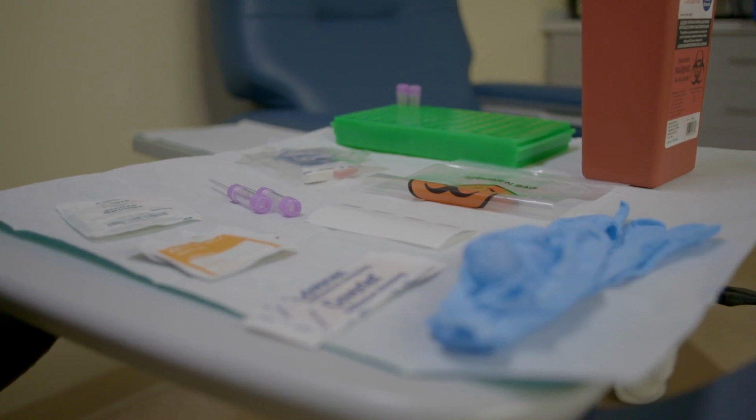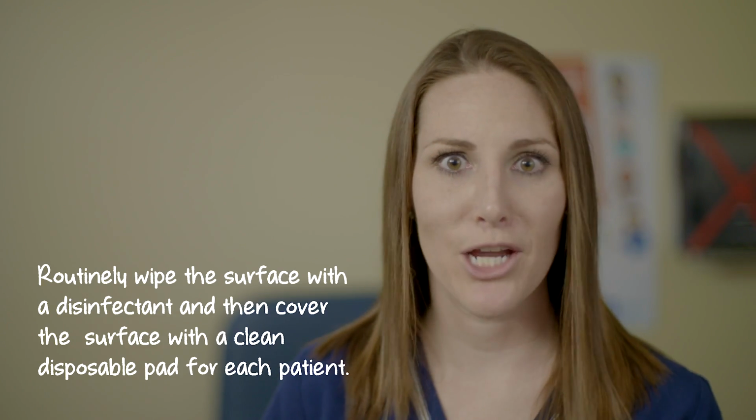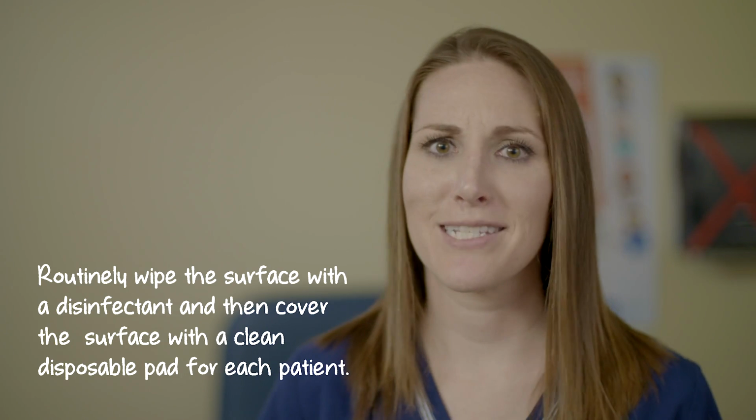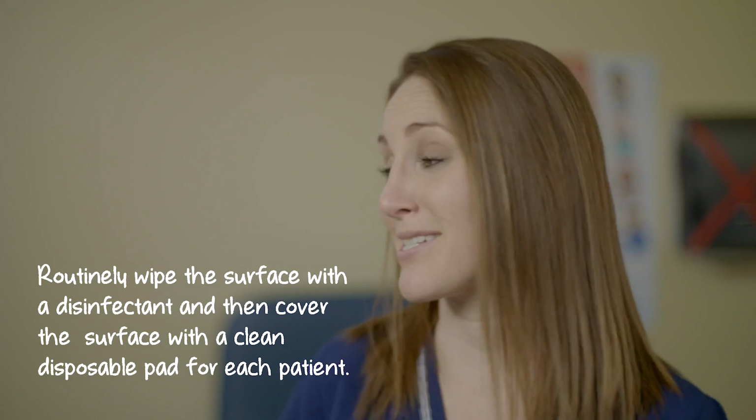As you can see, we're all set up with everything needed for a blood draw. And we're going to look into what we need to do to really prevent lead contamination as much as we possibly can. First, make sure that the collection area is as clean as you can get it. Wash down the collection area. All of the packaging is sealed until just before you're going to use it. You can also cover your materials until you're ready to use them. You're trying to make your collection area as lead-free as possible.